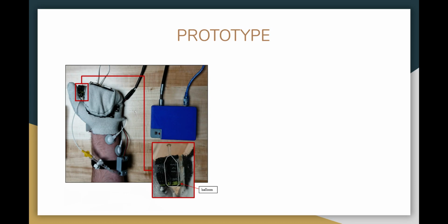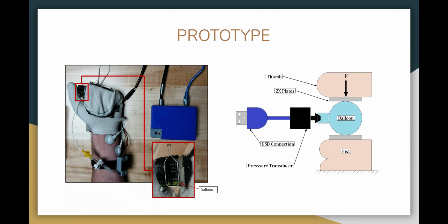The device involves the use of a peripheral nerve stimulator, same as the standard technique. The electrical impulses make the thumb twitch. A pressure balloon is mounted at the thumb. When the thumb twitches, it applies pressure in the balloon. The difference in pressure inside the balloon is transmitted through our pressure transducer to our computer. Then our MATLAB code gives us a train of four count and a train of four ratio. Here is a diagram that makes the device easier to understand.